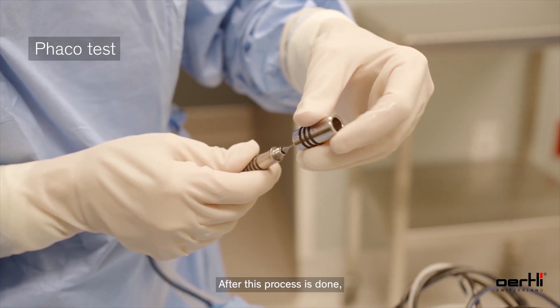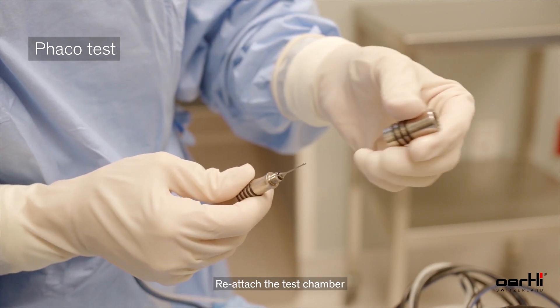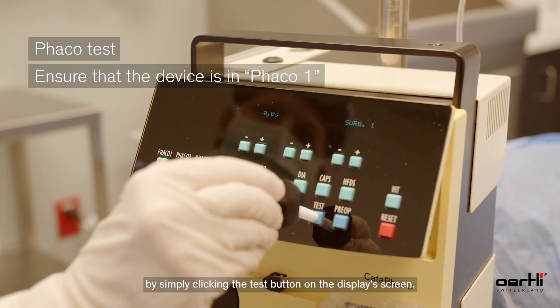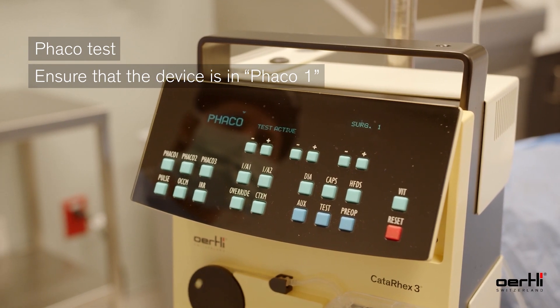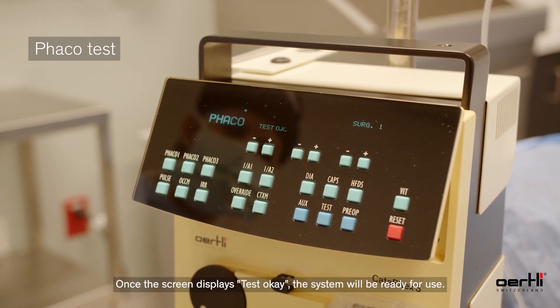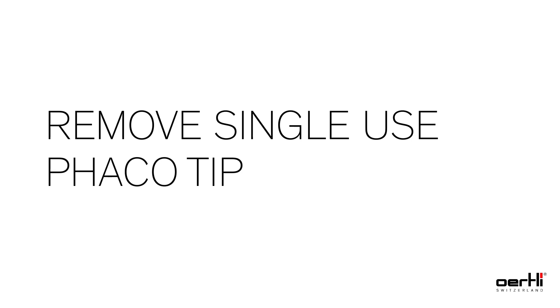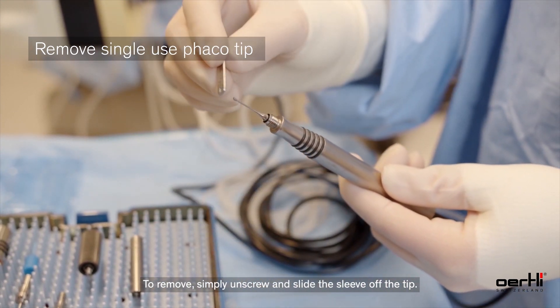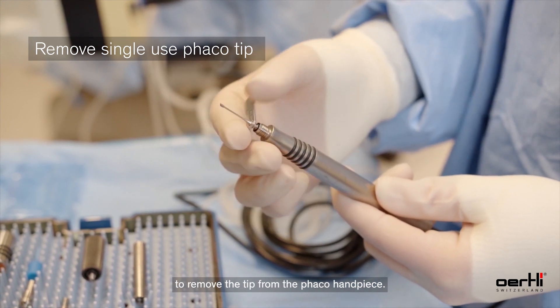After tightening the tip, put the sleeve back on the tip, reattach the test chamber, and go through the FACO test process again by clicking the test button on the display screen. Once the screen displays test okay, the system will be ready for use. To remove, simply unscrew and slide the sleeve off the tip, then use the single-use disposable wrench to remove the tip from the FACO handpiece.